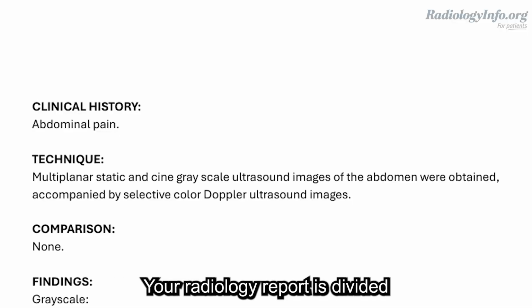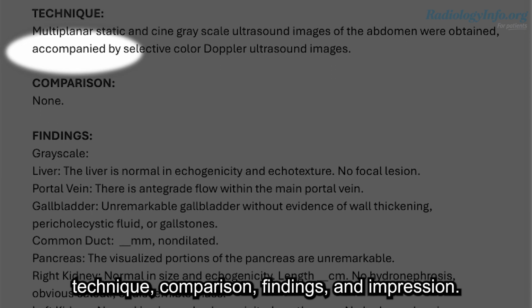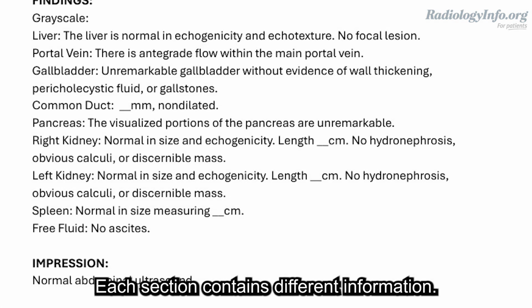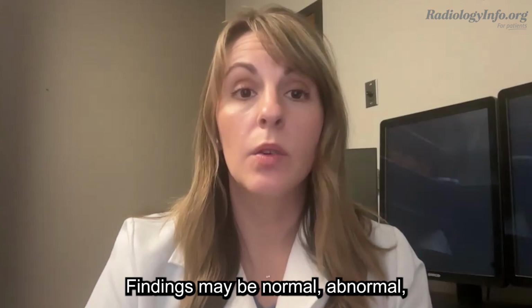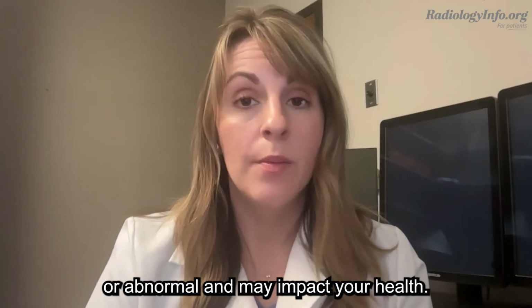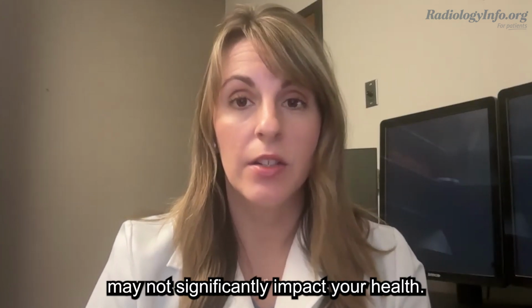organs. Your radiology report is divided into different sections: clinical history, technique, comparison, findings, and impression. Each section contains different information. The findings section lists what the radiologist saw on your exam. Findings may be normal, abnormal but not likely to cause problems, or abnormal and may impact your health. Keep in mind, some abnormal findings may not significantly impact your health.